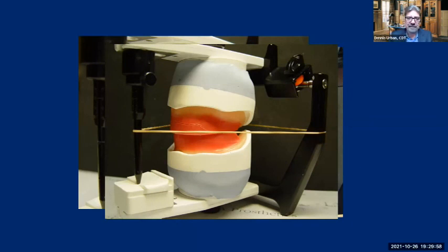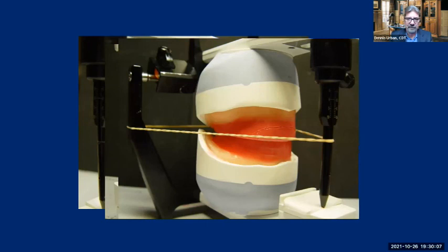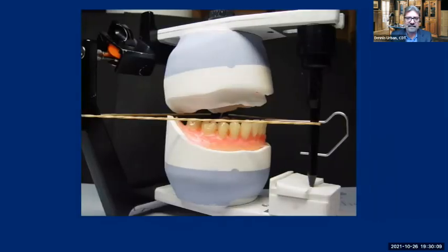This is your Camper's plane, or plane of occlusion, and you can set those models perfectly when you're articulating these cases. This way we can mimic that occlusal plane that we need. Beautiful articulation here. We're setting our denture teeth. I usually set up the upper anterior teeth first, then the lower anterior, then upper posterior and then lower posterior. Then I go upper and lower, finish it, and check my working and balancing.